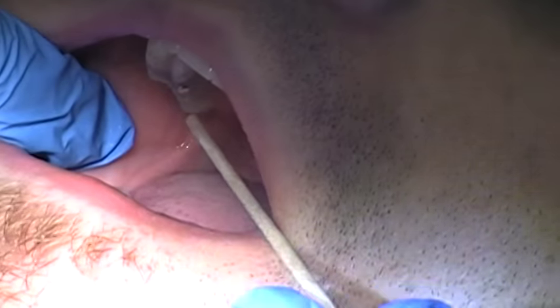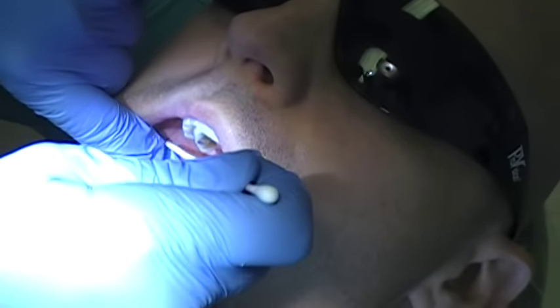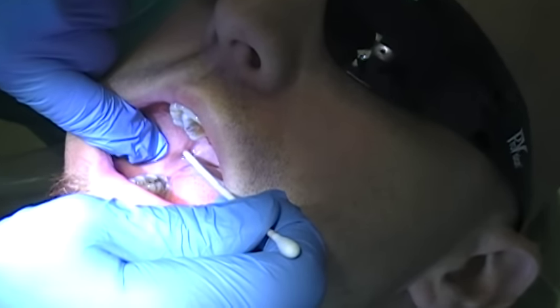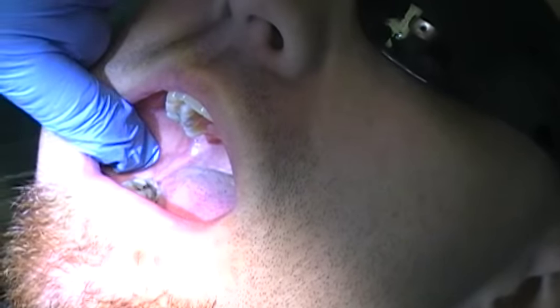You also want to bring the barrel over to the contralateral commissure — the commissure on the other side. Then look and make sure that you're right over the premolars. And then you want to head in parallel to the occlusal plane.